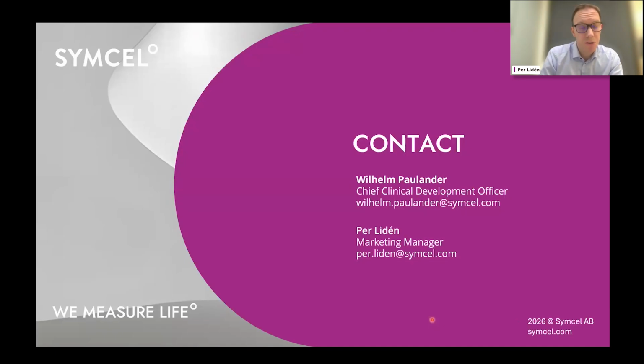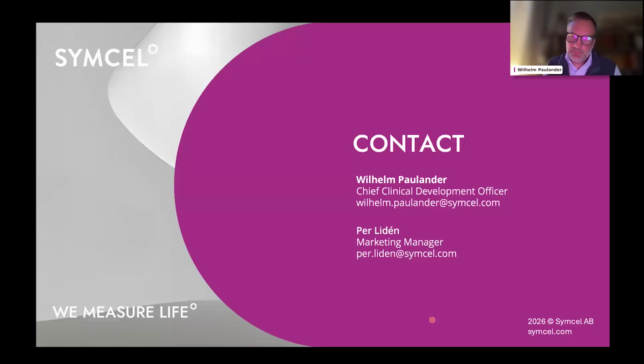There was a question on the volume. Say there is an even larger volume than 1 milliliter. Any more points to mention there on volume and the system? Yes, I think the system is applicable up to a certain volume. At some point, it's not applicable any longer if you have to use too many vials.